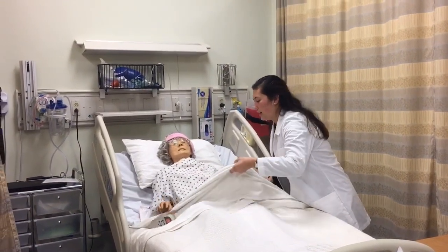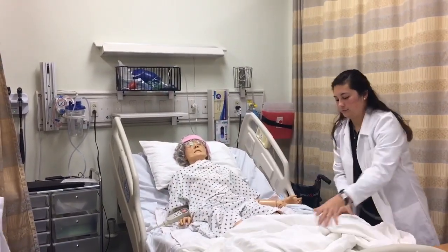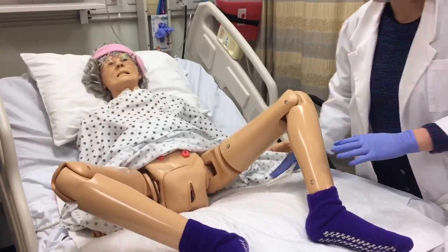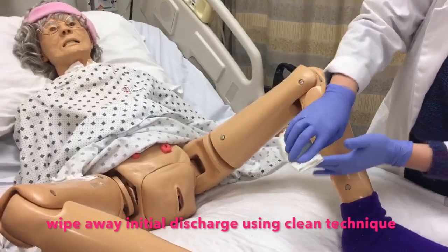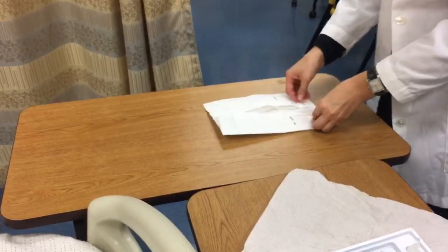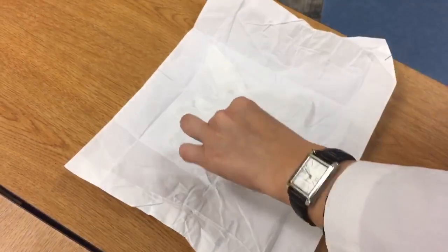And I'm going to go ahead and move your legs into a frog position. When applying sterile gloves, remember to only touch the lower cuff as to not contaminate the rest of the glove.